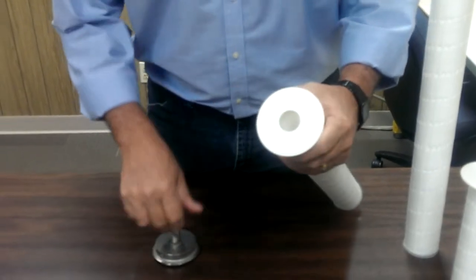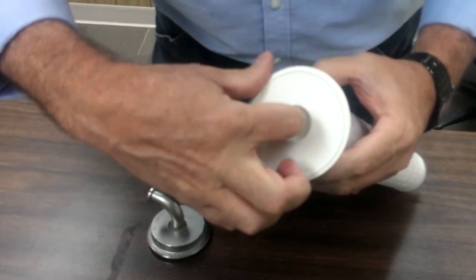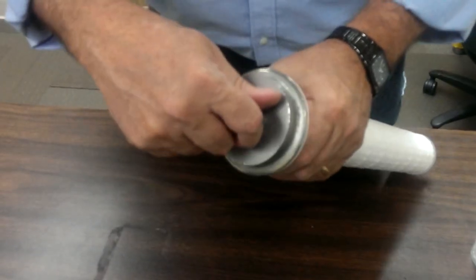So what causes this is inside the filter — if you feel on the inside edge, there is a lip here that is preventing the cap from inserting all the way.